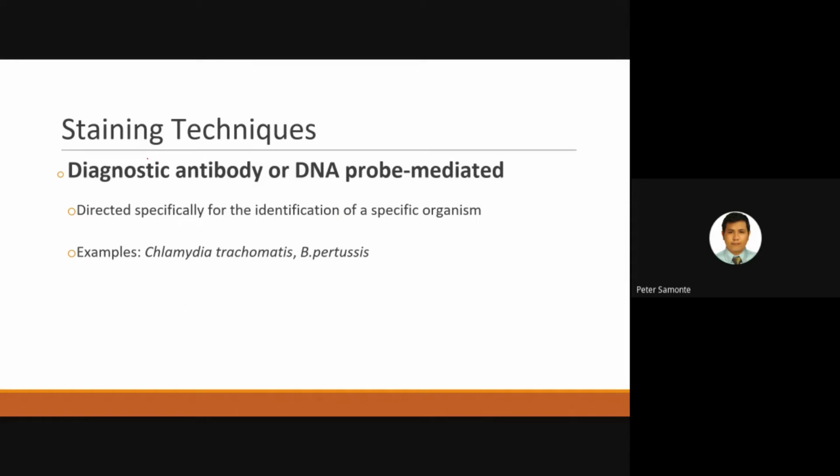Now, for your staining techniques, another example would be your diagnostic antibody or DNA probe mediated, directed specifically for the identification of a specific organism. An example for this, class, would be your Chlamydia trachomatis and Bordetella pertussis.